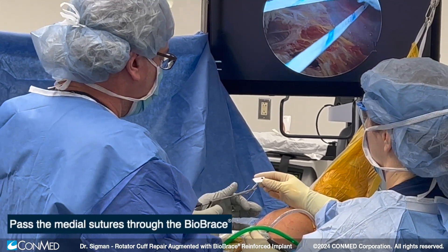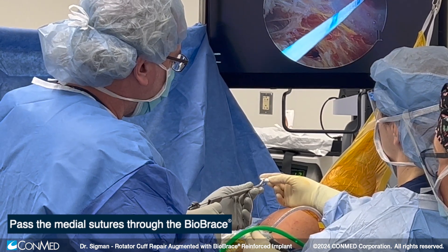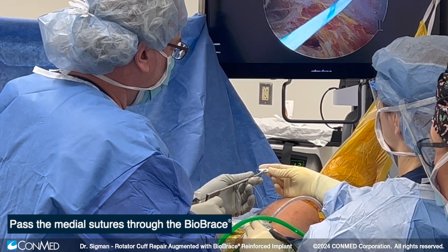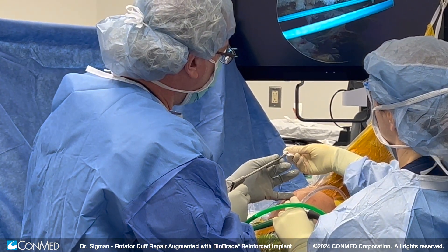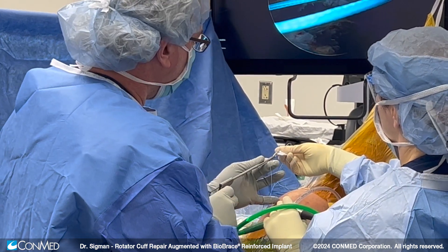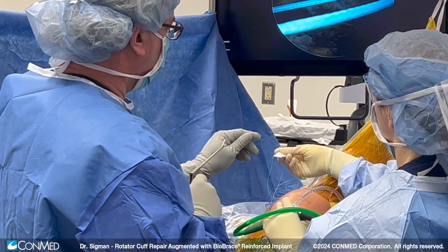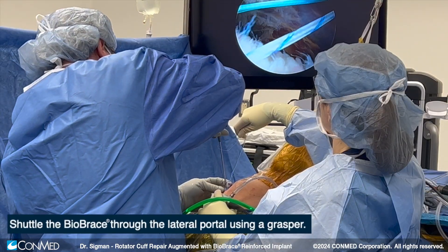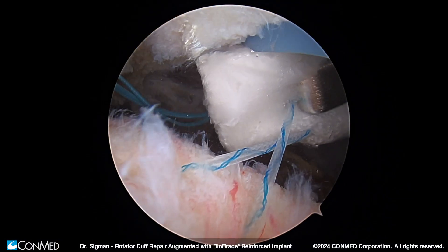Now we have carefully removed our sutures out and through our low-profile cannula to make sure there's no twisting. We're using a standard suture passing device to pass our sutures through the medial aspect of the graft. As you can see, there's very ease of passage of these sutures due to the structural integrity of the graft. Once all four sutures have passed up and through, we're then going to place our implant through our low-profile cannula.